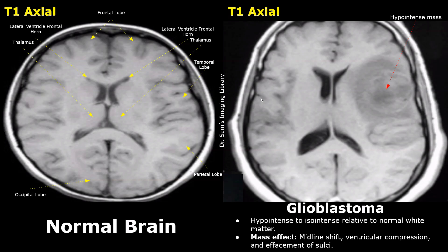The image on the right shows a mass in the left side of the brain — this was a glioblastoma. A glioblastoma usually appears hypo-intense or iso-intense to the white matter in a T1 weighted image. This mass is hypo-intense; you can see that it is darker than the white matter. The mass is large and causes a mass effect, referring to the compression of nearby structures. The lateral ventricles are compressed and displaced, and this mass effect is significant enough to cause a midline shift — you can see a rightward displacement of the midline.